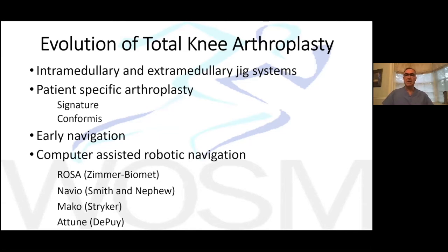And that is what the current system has aimed to get, that last 3 to 5% of patients where we as surgeons could have done better. An experienced surgeon in the opinion of the American Academy of Orthopedic Surgeons is a total joint surgeon that does at least 50 cases a year. That's a fairly low bar, and I think that the data supports that for a high volume surgeon, somebody who does several hundred joint replacements a year like myself and some of my colleagues, the jigging systems that are presently in use should have an accuracy of 95% or greater.